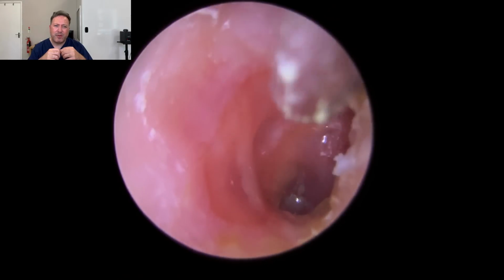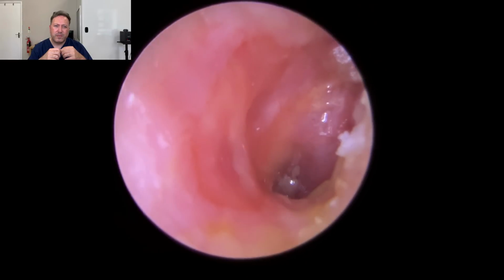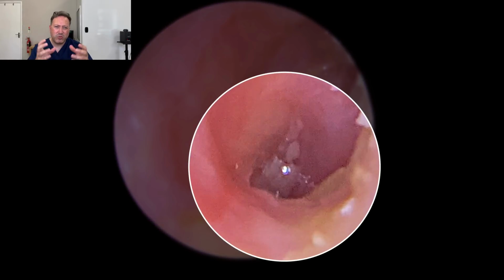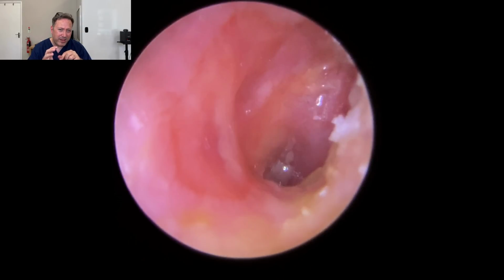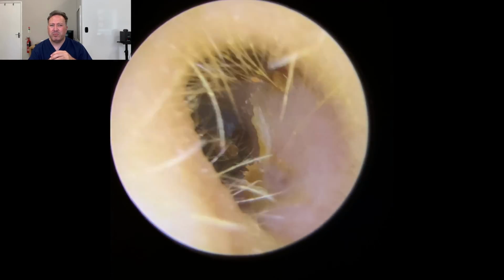Just tidying up around the outside edge now. There we are. Okay, so just zoom this out so you can actually see that wet material. You can see the hole there a little bit more clearly when you zoom it in there. So yeah, this patient does have another discharging perforation.